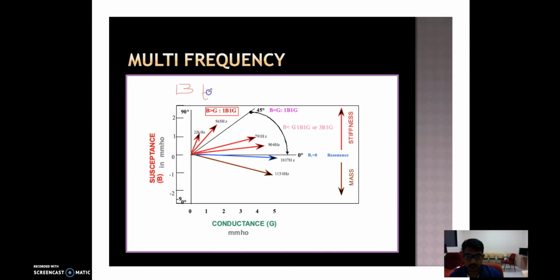Bt is equal to minus Bm plus Bs, excuse me for the poor handwriting. Together it is considered as Bt, so the resultant is equal to one value, say, probably x. Similarly here, the capital B is nothing but the Bt.